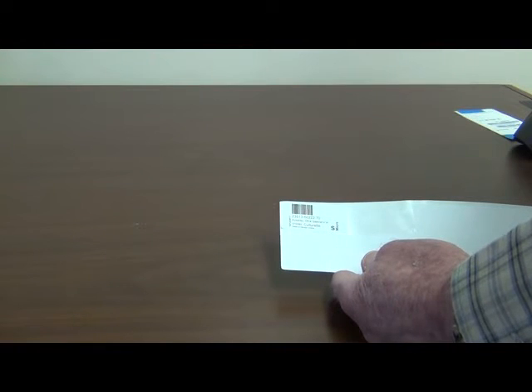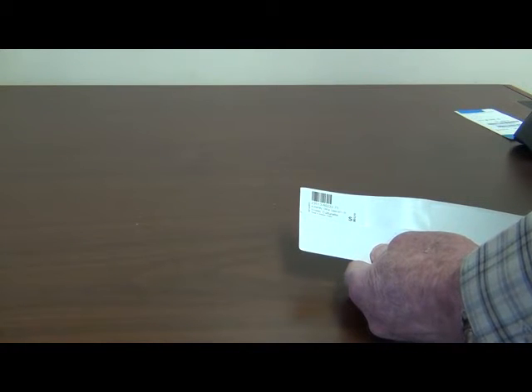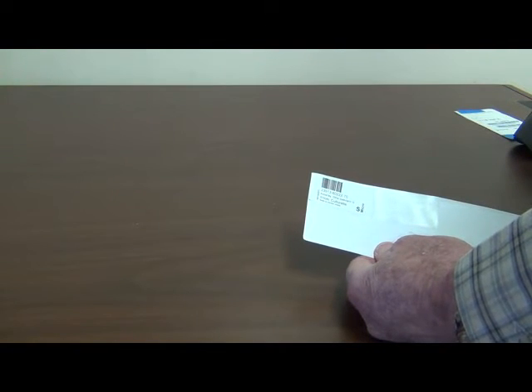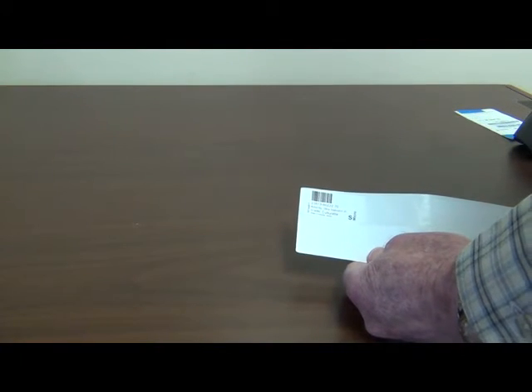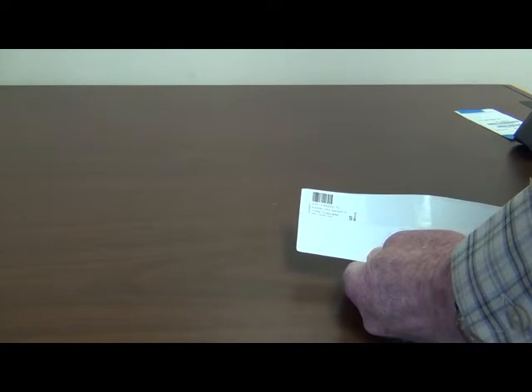It is important to follow up and shoot for a resolution to all these types of problems, especially early on in the UDI program. Remember that an ISO grade of 2 is the minimum required print quality grade, and on most of the printers that print these types of labels, a grade 4 or 3 is within pretty easy reach. It just starts with a good label design.